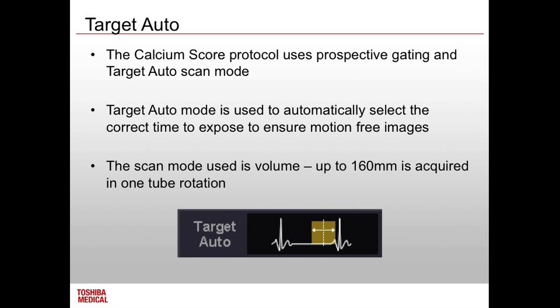I've seen this done on a patient who had increasing episodes of chest pain. She was an athlete, and the chance of her having coronary artery disease was really zero, but they still wanted to do the scan, so they did this and kept the dose to something like 0.5 of a millisievert. She was tiny as well. She's an athlete, so that helped.